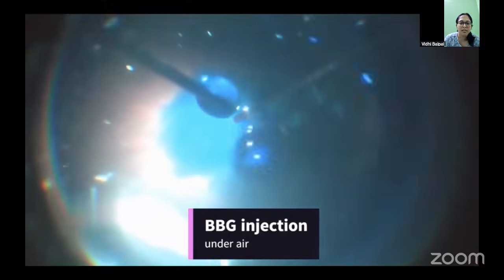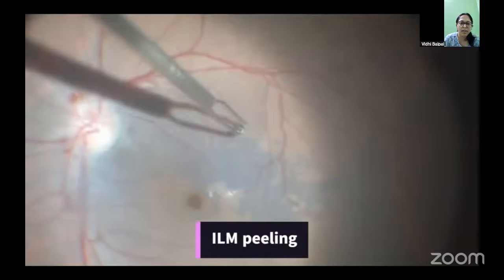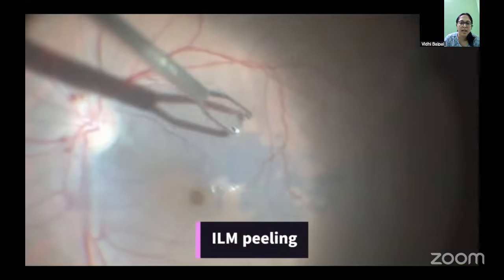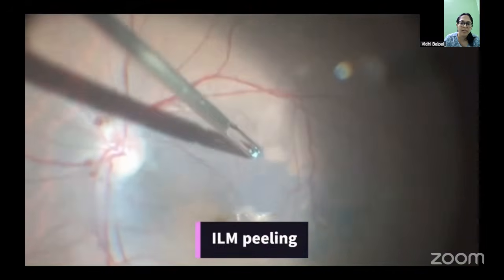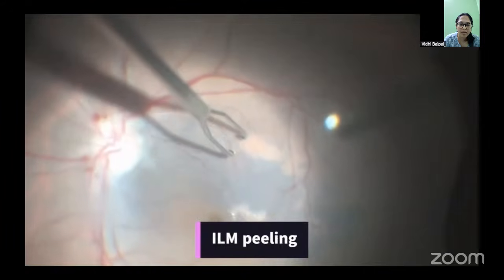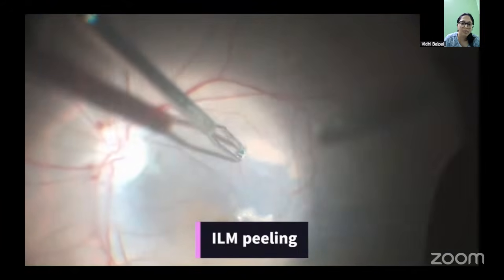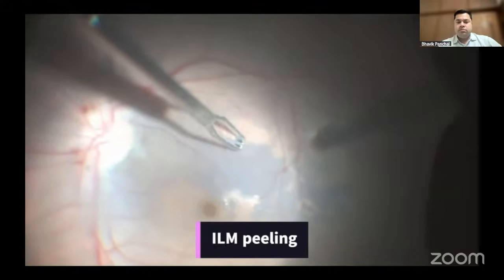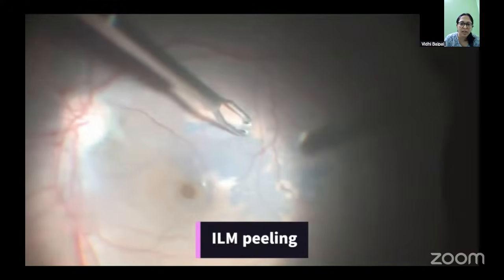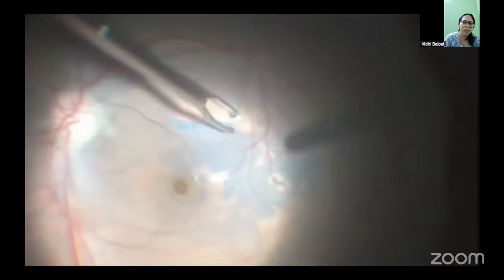After that, I stain. I preferably stain under air, and then I start from wherever is the area most accessible to me and the one which I feel is stained best, and I go around in a circumferential fashion, making multiple flaps. So this is the first flap that you see in the video that I'm raising. I'll take this flap till the edge of the macular hole and leave it there. I do not like to touch the macular hole in any fashion.